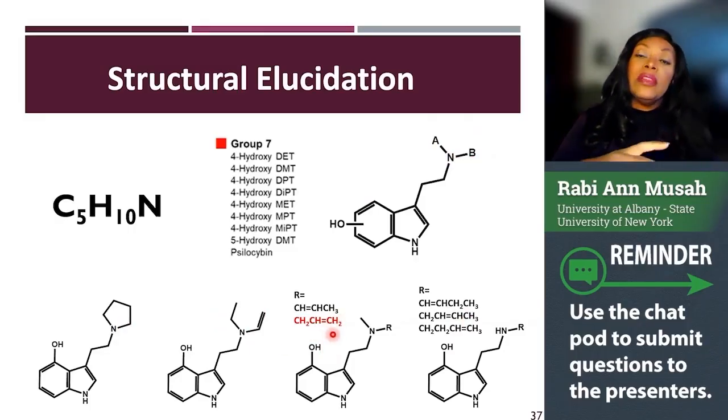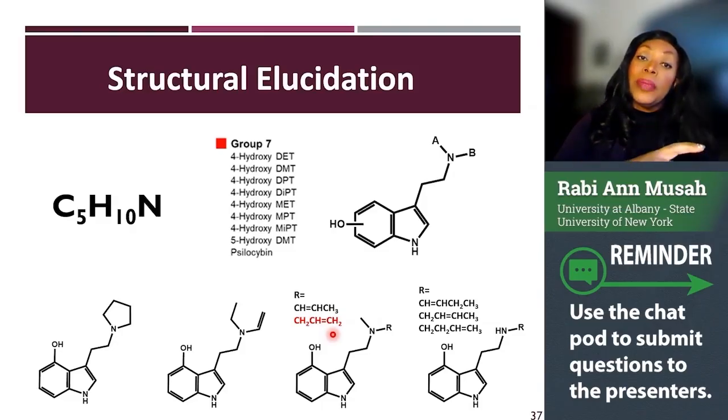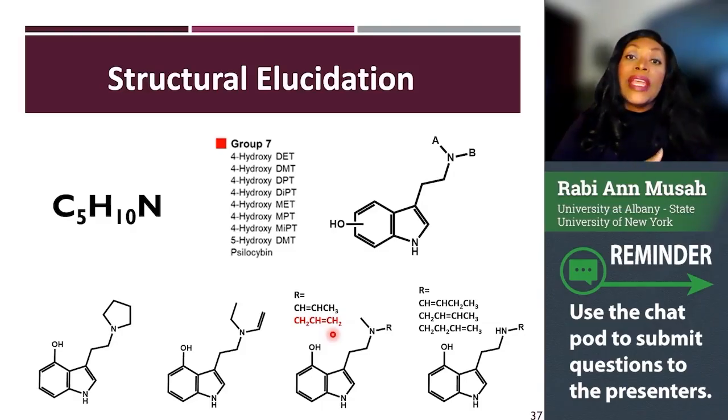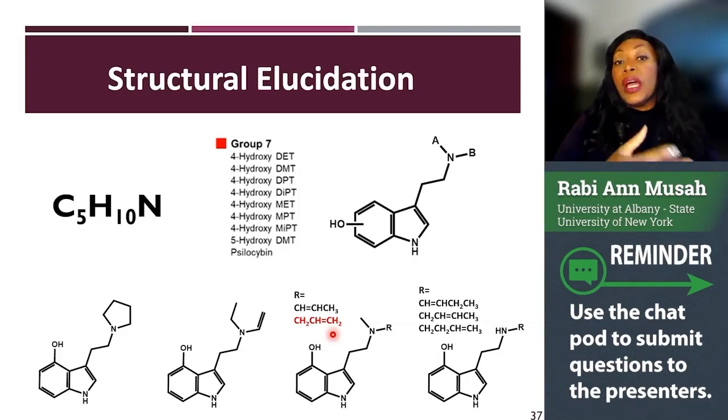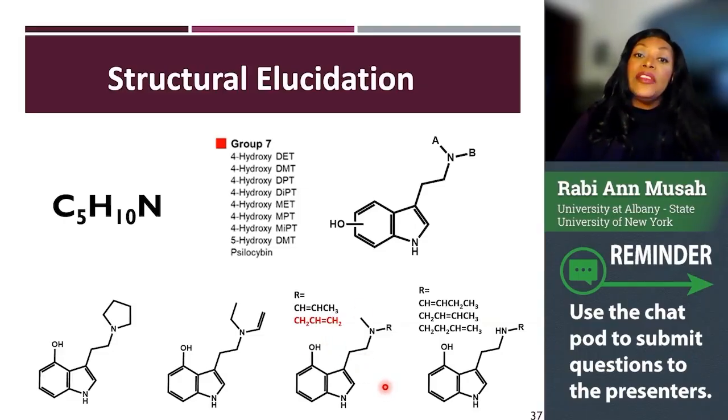Now, just to illustrate how powerful this is, if you were to take that initial formula and screen it in SciFinder, you would get 32,000 possible molecules. Whereas if you were to take that structure and put it in this database, you would come up with 28. And even though that's a lot smaller number, none of them happen to be, at the time of this presentation, the correct structure. And yet doing it in this simplified way allows you to predict that it's one of these 7 and readily figure out that it happens to be this one from additional work that you could do.